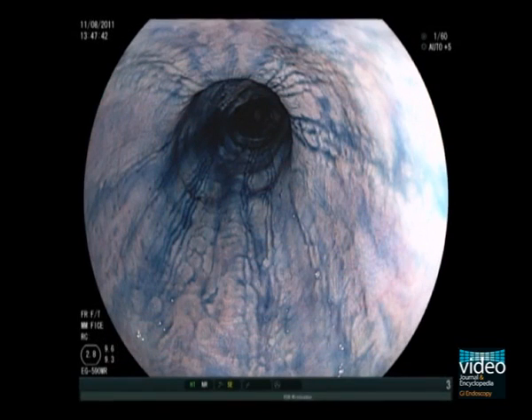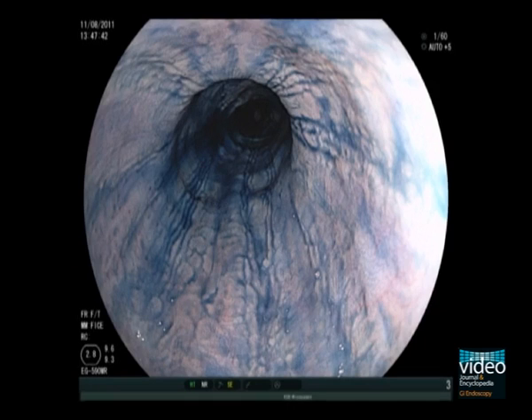Furrows can often be very subtle and can easily be overlooked. In patients with typical symptoms, chromoendoscopy with indigo carmine can help to visualize those subtle furrows.